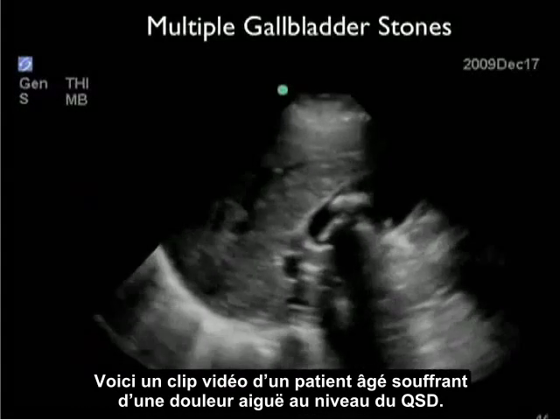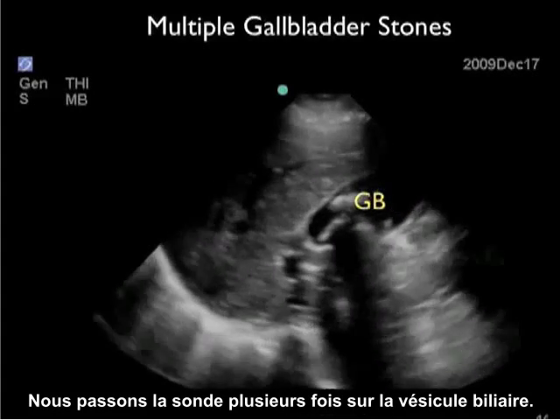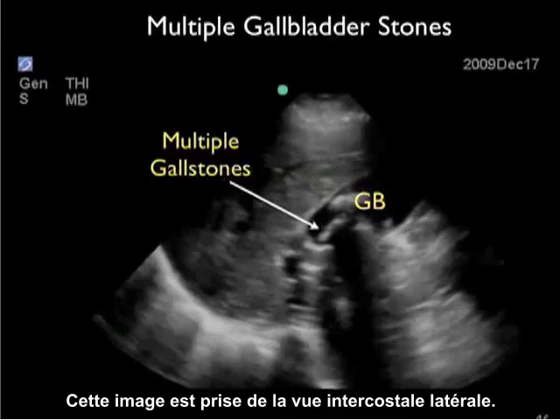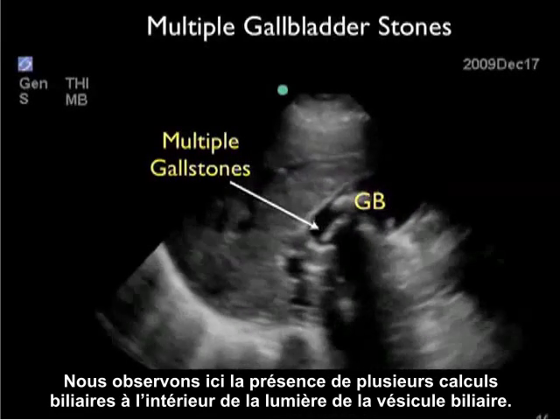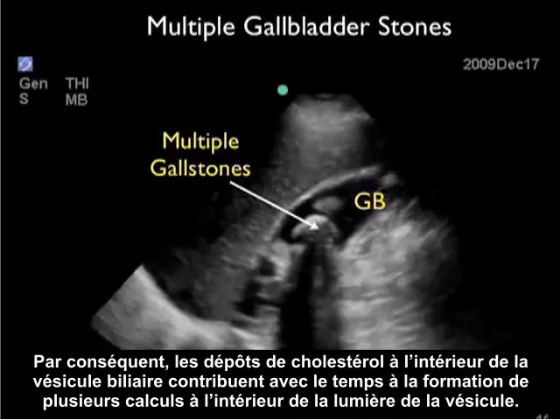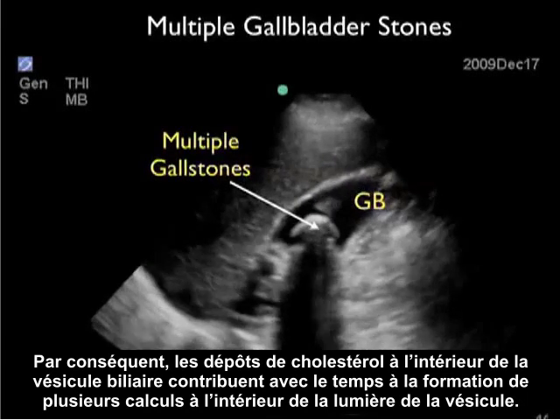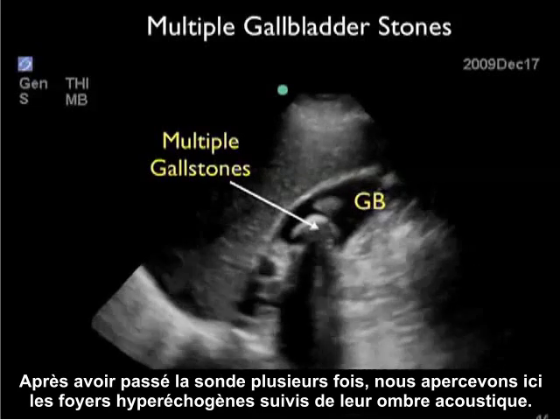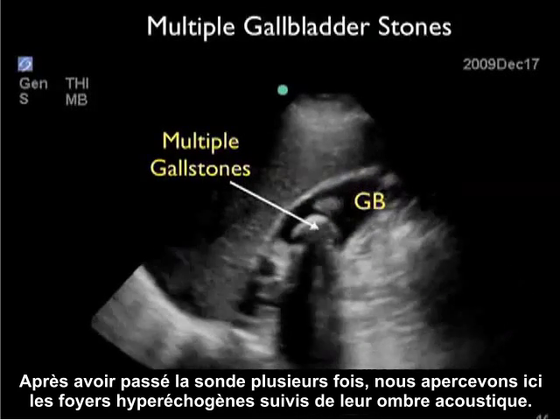Here's a video clip taken from an elderly patient with acute right upper quadrant pain. We're scanning back and forth through the gallbladder from that lateral intercostal view. We see the presence of multiple shadowing gallstones within the lumen of the gallbladder — the end result of cholesterol deposition forming multiple stones. As we scan back and forth, we can see the multiple hyperechoic foci with posterior acoustic shadowing.